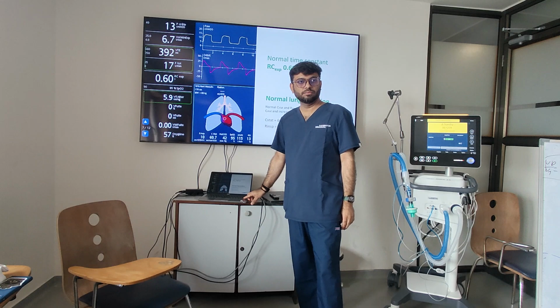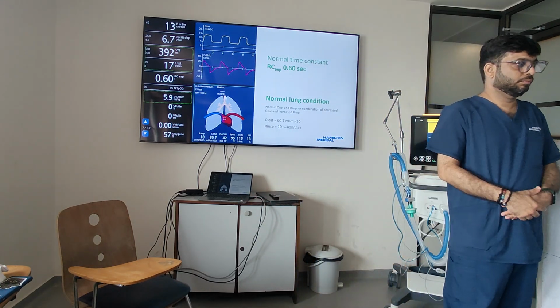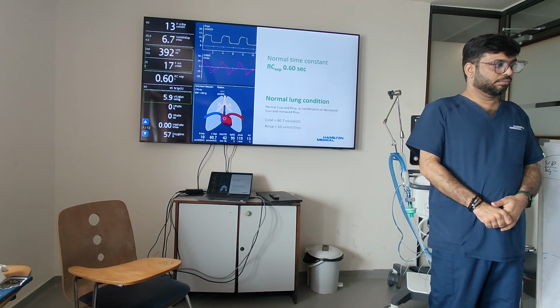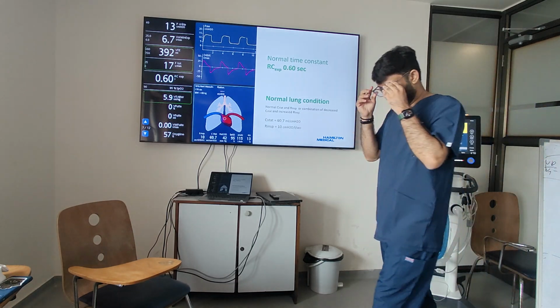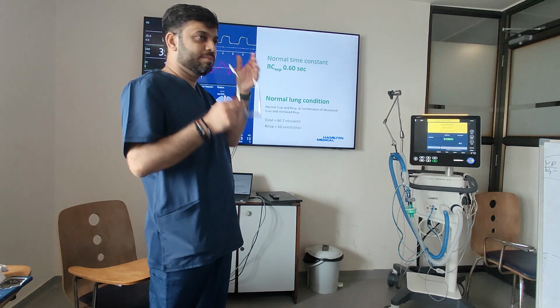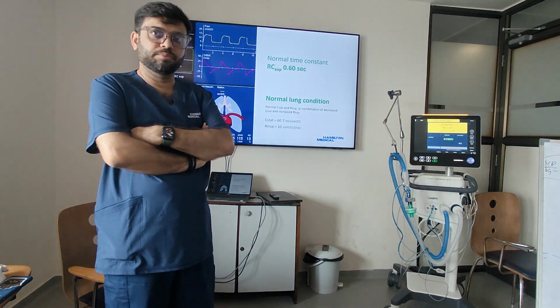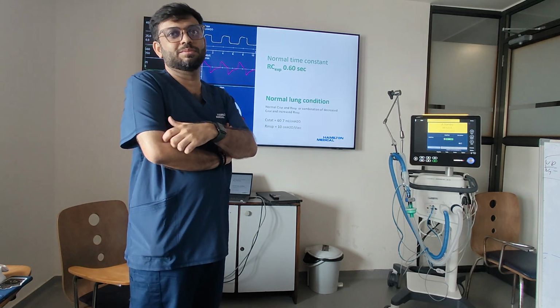Basically, it's taking our work on itself. So what would you do otherwise? You will see the driving pressure, you see the plateau pressure and change accordingly. What it is doing is, it will maintain the driving pressure and plateau pressure, which are very important, but the tidal volume may vary. So don't worry about it being 6.7, close to 7. Don't worry about it, because this will be taken care of: plateau pressure and driving pressure. Because that's what determines your lung injury. It's taking care of that.